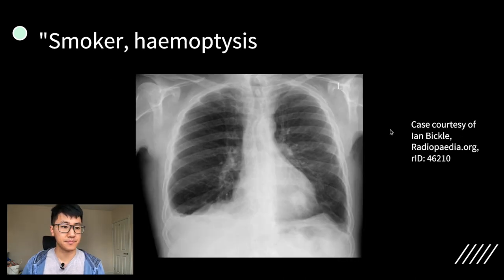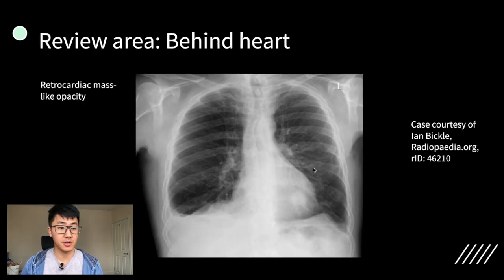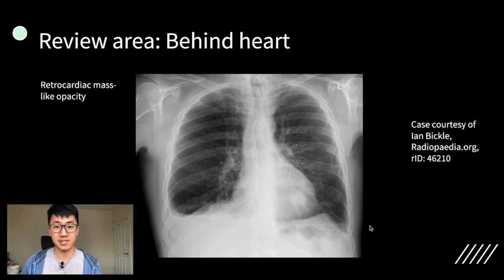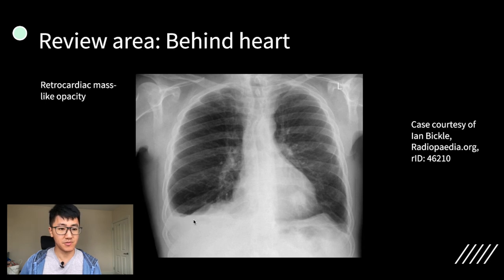Now try this one. The other review area is to look behind the heart, because the lung does go behind the heart, and you can see an ill-defined mass-like opacity. These are places where it's really easy to miss a lung tumour, so if you spot one you're potentially saving this patient's life. Well done to the eagle-eyed of you that spotted it. There's probably a small right pleural effusion as well.